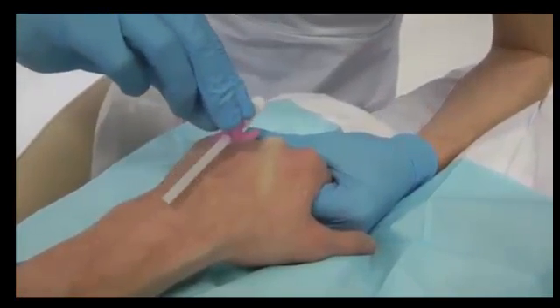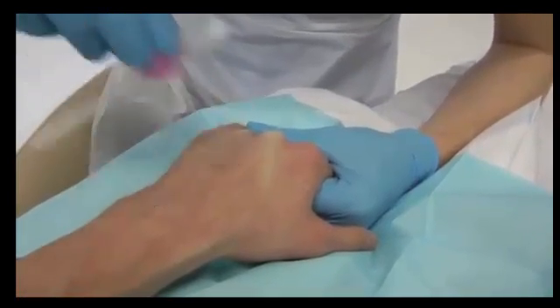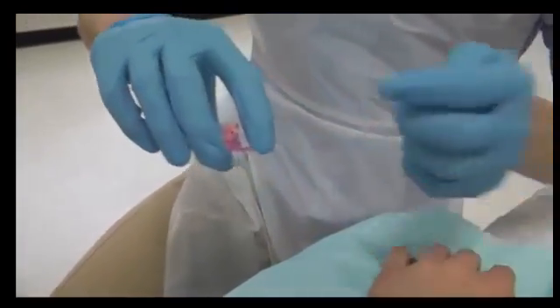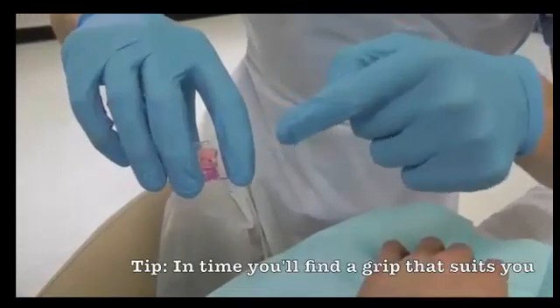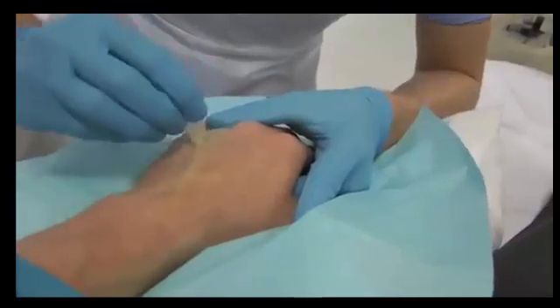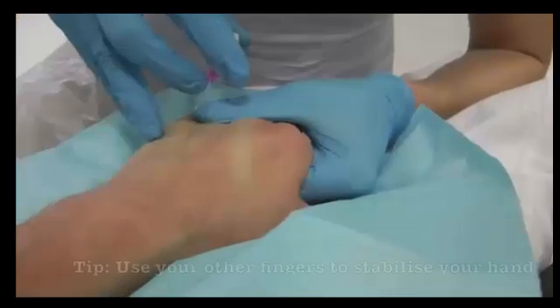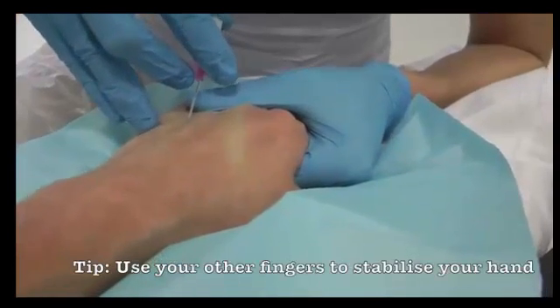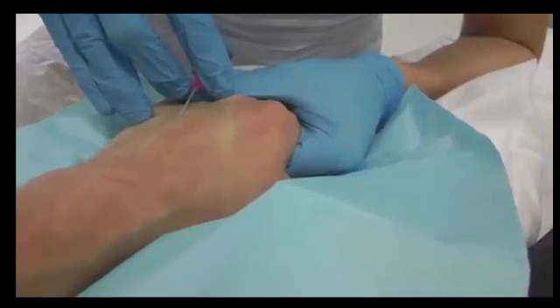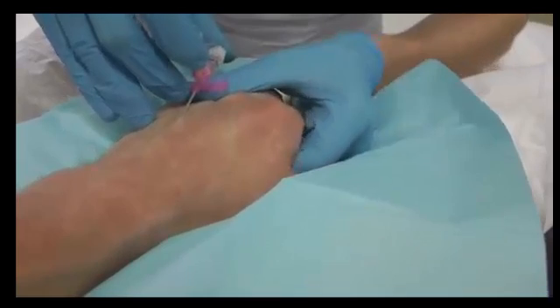If possible, try to avoid the length of the cannula crossing the joint. Hold the cannula firmly using your index and middle finger on the wings and your thumb on the back of the cannula to control the needle. Clean the area of the skin in a crosshatch pattern. Insert the tip of the cannula at an acute angle, then straighten and advance a few millimetres, keeping the skin tight to anchor the vein.